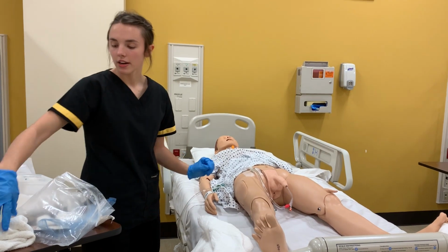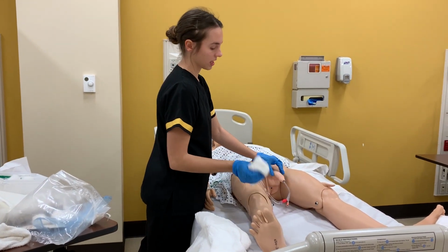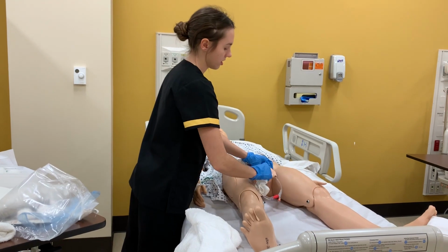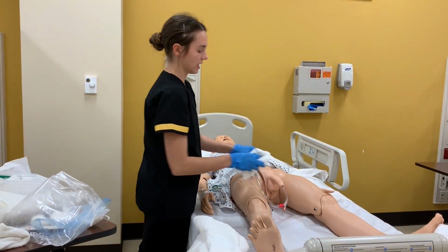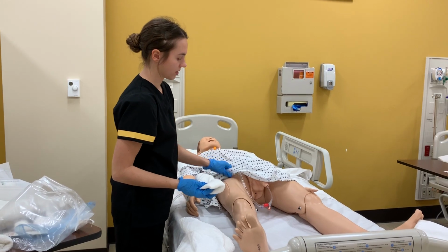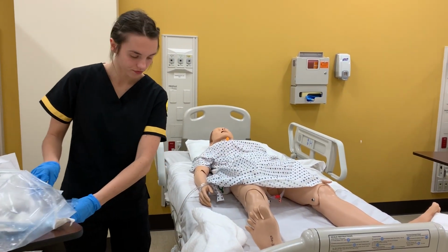And also, we are going to take a clean rag, and since we put betadine on, we're just going to clean, just like a normal cleaning. So with warm water, you would go around, warm water, go around, and if there was any left, you could do it one more time and go down the shaft. And that would be all. So I can cover you up so I can get a clean sample.